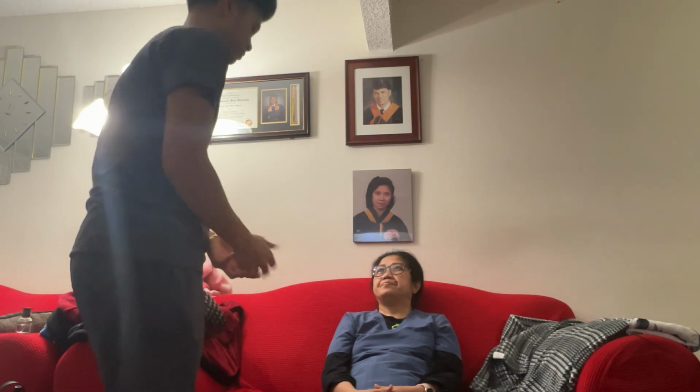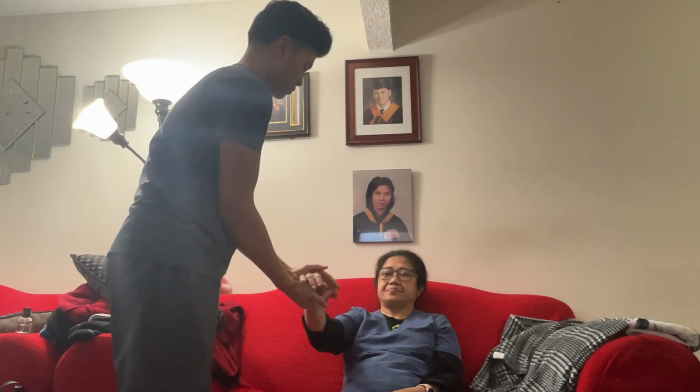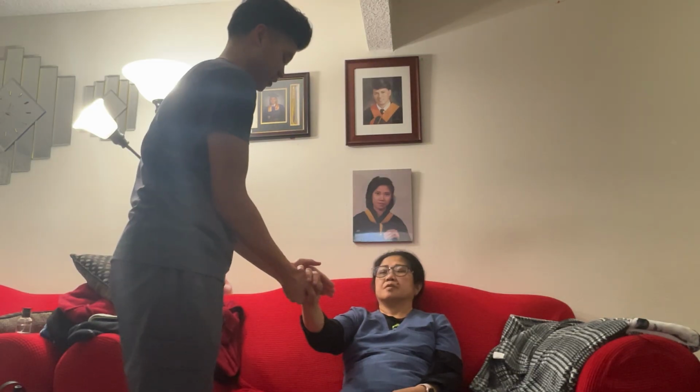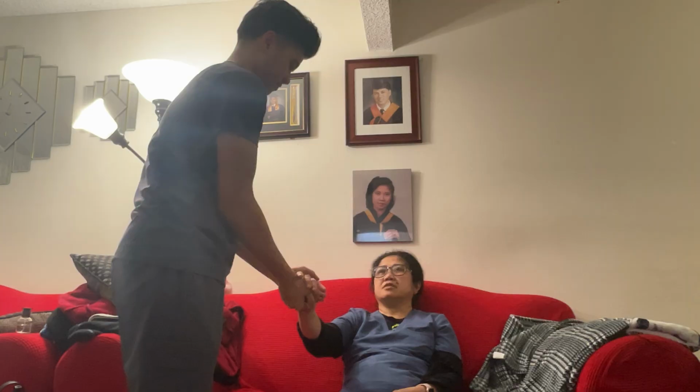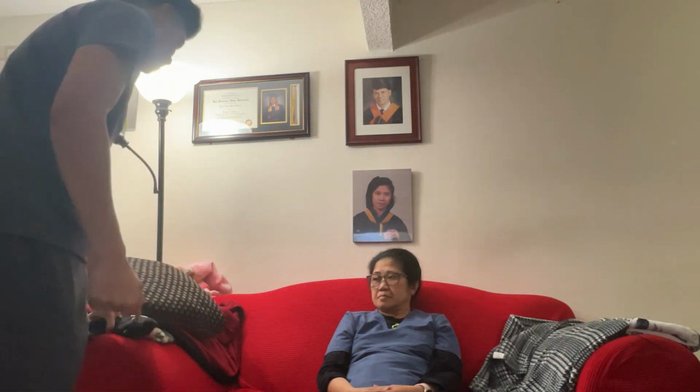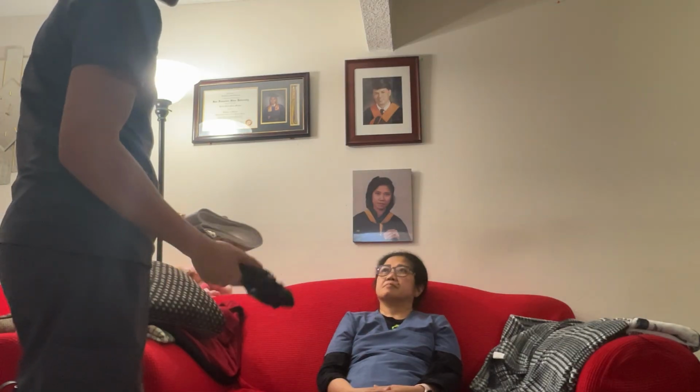Then I will greet the patient. Hi, I'm Aaron. I'm your nurse today. Can I please see your right wrist? And can you please confirm your two forms of identification, your full name and date of birth? Mira Luna Marquez, September 11, 1966. All right, thank you very much. So with that, we're confirming the patient's identity, and now we're able to move forward and tell the patient what we're doing. So today the doctor's ordered some ambulating.